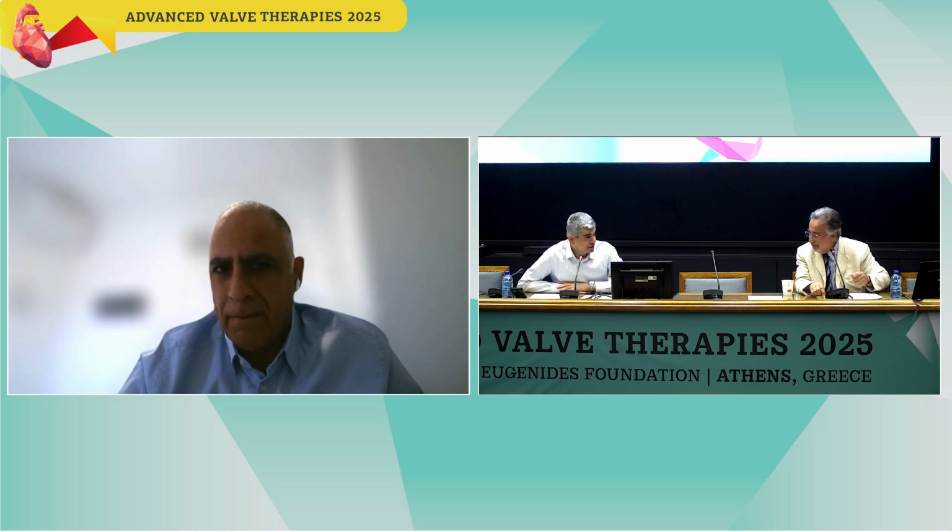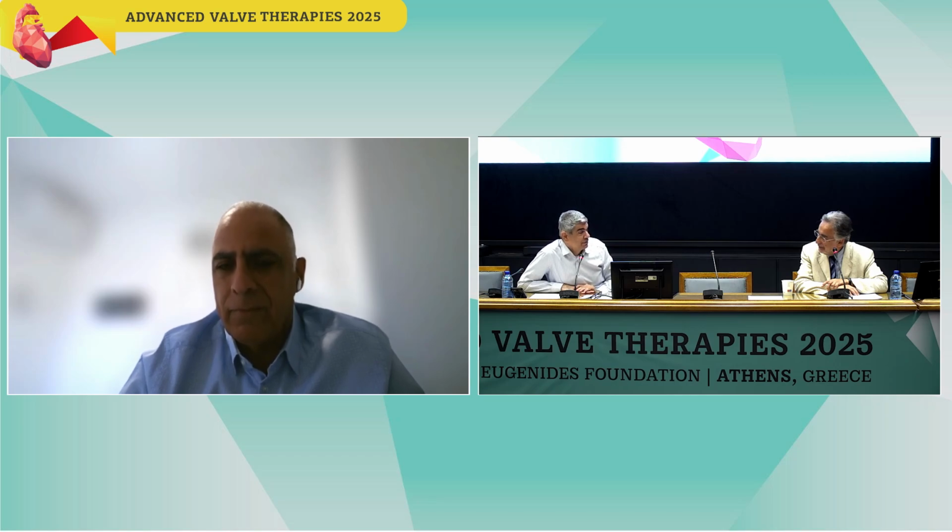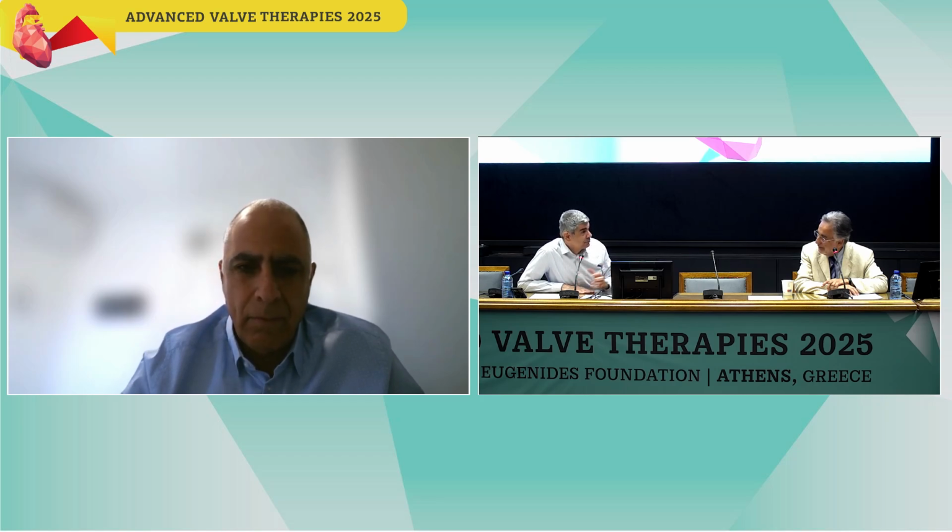Exactly, and it's not only echocardiography that will guide us in terms of success of the procedure, but also hemodynamics. Sometimes I've been in cases where the hemodynamics don't improve, and you really have to wonder whether your strategy or the position in which you put the device is wrong, and maybe reposition in a different way to improve your hemodynamics. Even though the color might look better, if hemodynamics persist, then you have to go back to that.